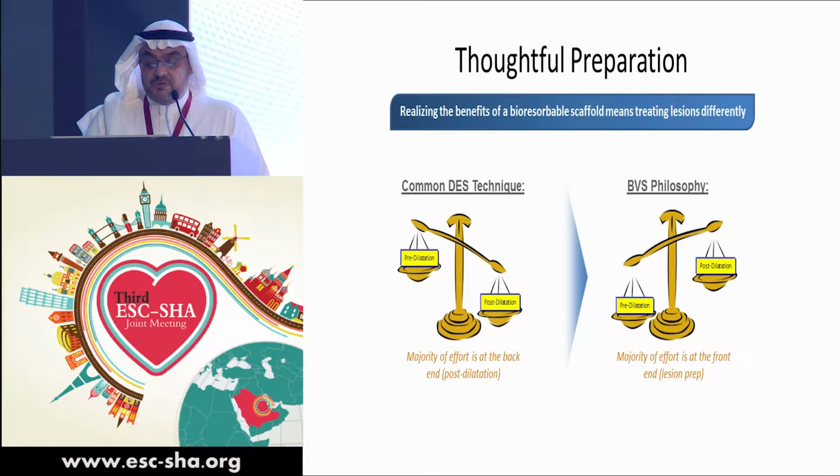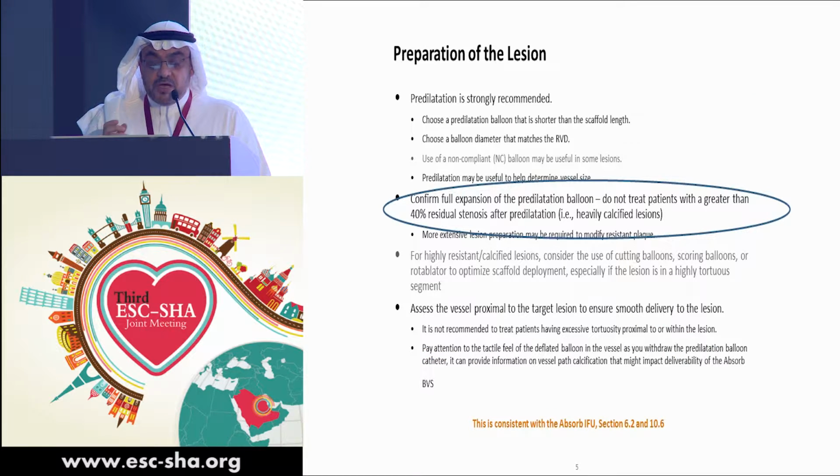It is not forgiven if you forget, and I'll illustrate this with one case. Before you put your stent, you have to have less than 40% residual stenosis, so you have to have well preparation of the lesion, and this is very important.